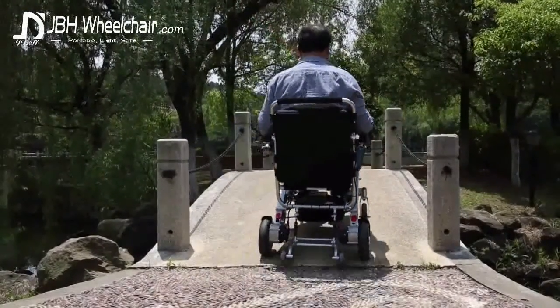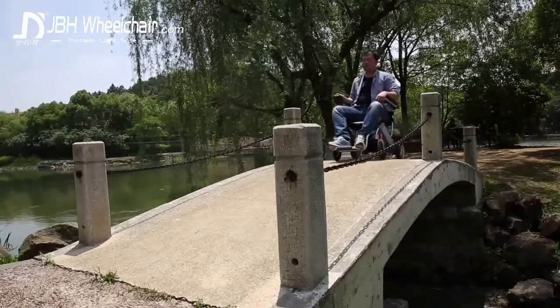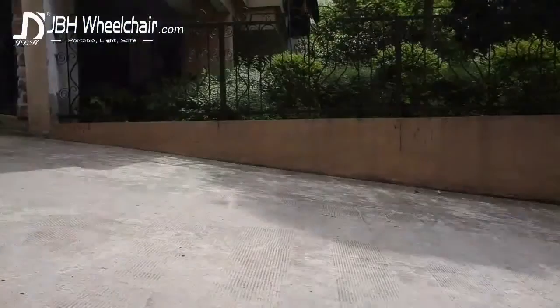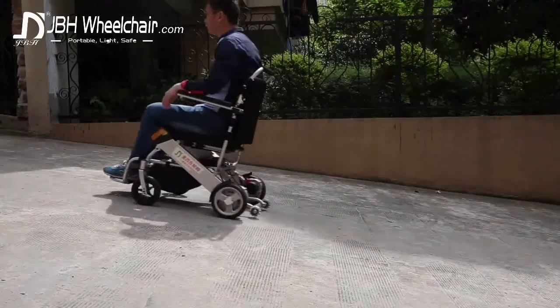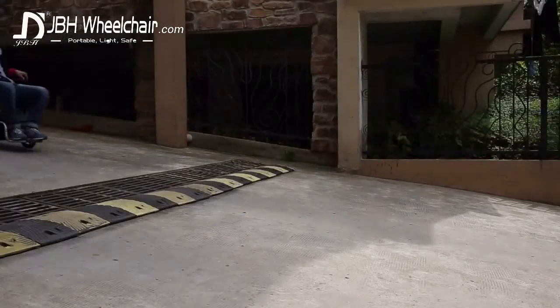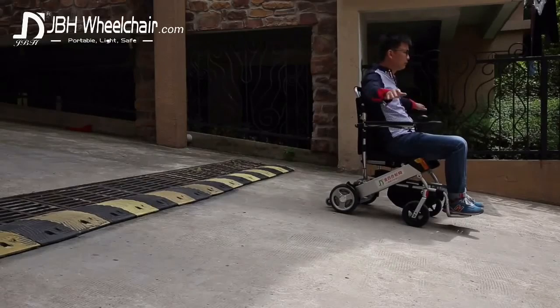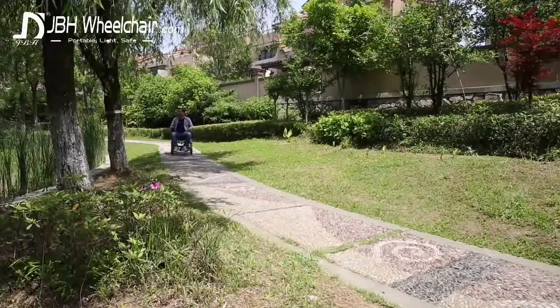The JBH D05 can tackle a wide range of obstacles with ease, able to travel up or down a 12-degree gradient. The freedom to travel in complete, perfectly balanced safety — you will never have to worry that the chair will tip backwards. An intelligent electromagnetic brake system is included. Look, no hands! Give yourself the opportunity to be spontaneous, without risk.